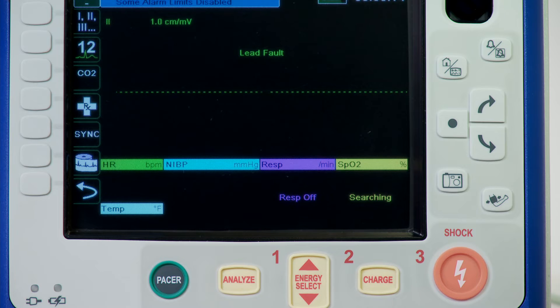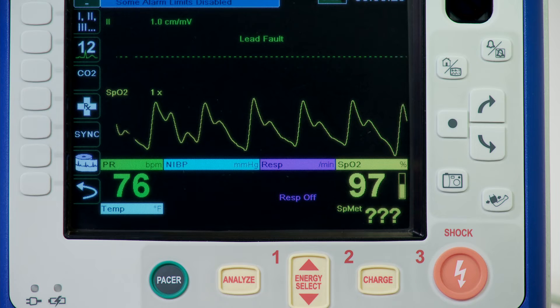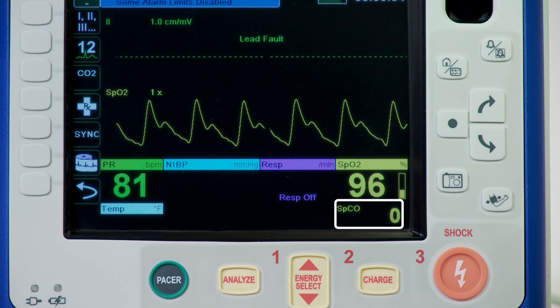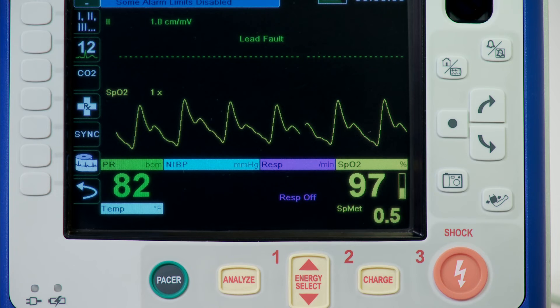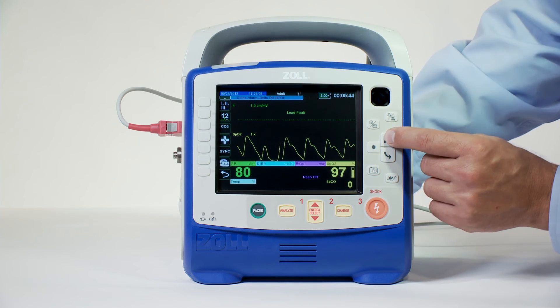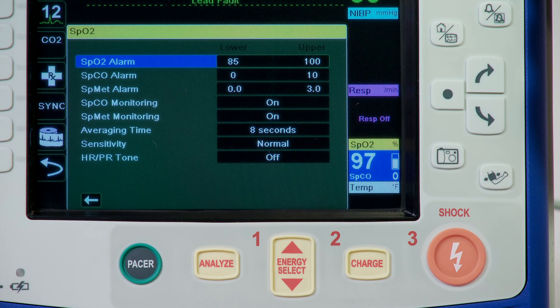The monitor displays this as SpO2 percent. It will automatically display the SpO2 value and pulse bar in a large numeric format, with additional co-oximetry options automatically scrolling in the lower portion of the SpO2 window. If SpCO and SpMet are installed, those measurements will automatically appear and alternate underneath the SpO2 display, eliminating the need for users to request information and increasing ease of use. Use the navigation keys to highlight and select the SpO2 numeric display to open the SpO2 parameter control panel, on which you can select options that optimize the use of SpO2.